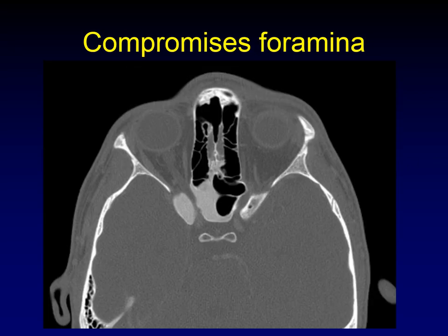Famously, fibrous dysplasia compromises underlying foramina. Here's a great example of expansile bone in the sphenoid wall and in the anterior clinoid process coming together to compress the optic canal. You can imagine the effect that this would have on vision — compromising foramina is one of the most important clinical problems that comes from fibrous dysplasia in the midface and skull base.